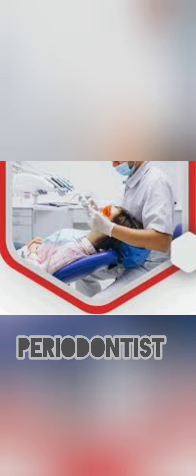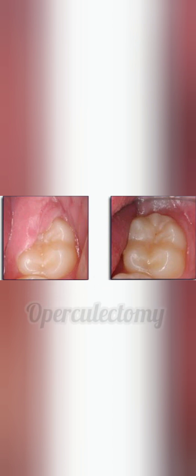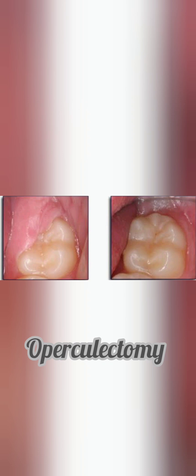A periodontist can treat pericoronitis by managing pain through an operculectomy procedure. Operculectomy is indicated when the tooth is partially erupted and the root system is still developing, and when the tooth is not altered in position or angulation. It is ideal when the tooth is erupting vertically with enough space to erupt.